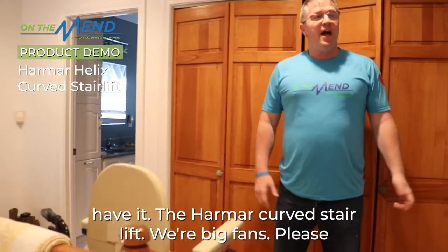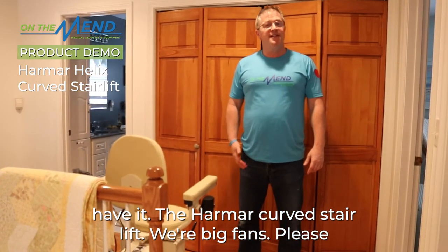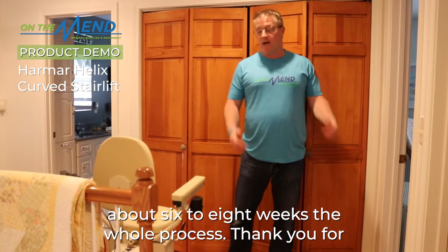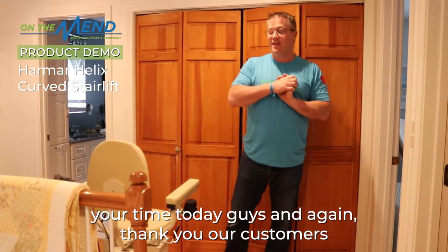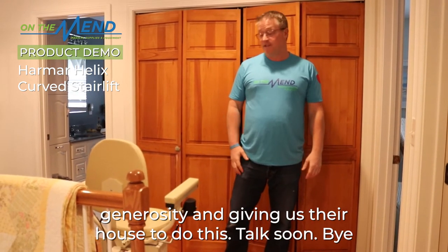And that's it — you get to the top, you get yourself off onto your rollator or however else you need to do it. There you have it: the Harmar curved stair lift. We're big fans. Please call us today if you need one — we can measure it out, it takes about six to eight weeks for the whole process. Thank you for your time, and again, thank you to our customers for their generosity in letting us use their home for this. Talk soon.